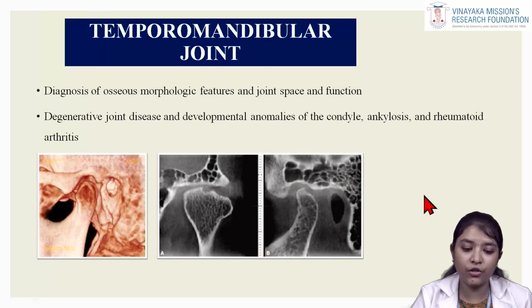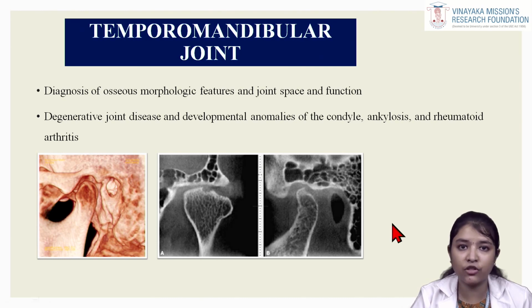The temporomandibular joint: it can be used for analyzing the morphology of the TMJ or any pathological condition. The joint space and the function can also be assessed by the CBCT.